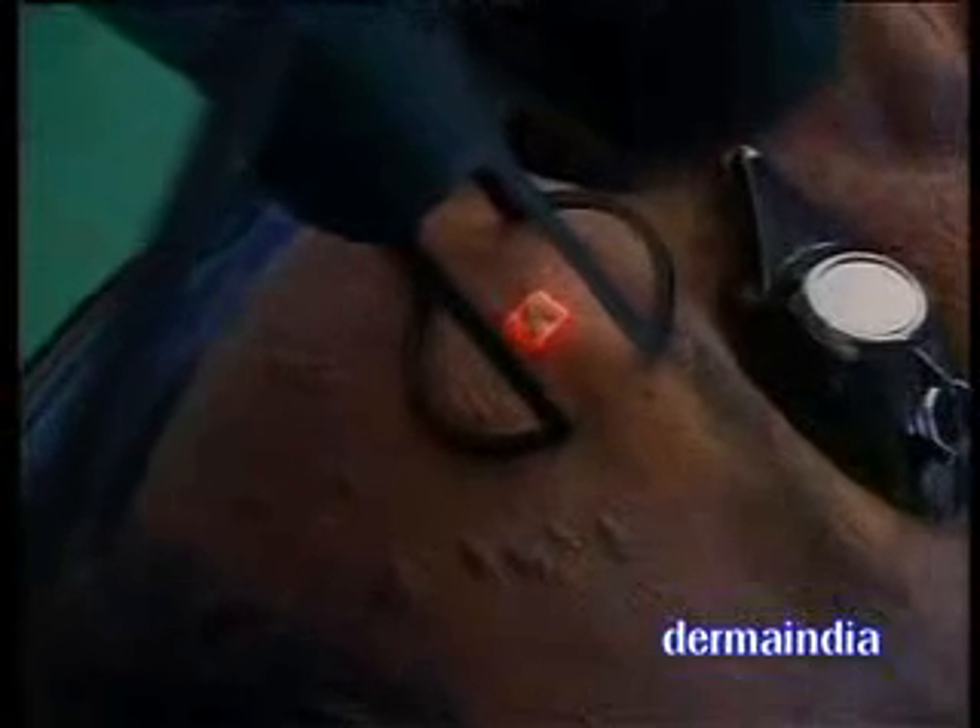Just see it. Since I kept it at 20 millijoules, you see one layer of skin is being removed. What you need to do is keep it again in the same area and press it again. If you keep it pressed, it will fire multiple times. Now the lesion is almost flat.